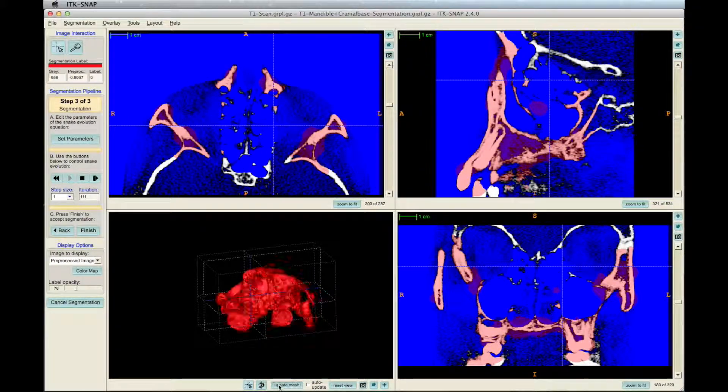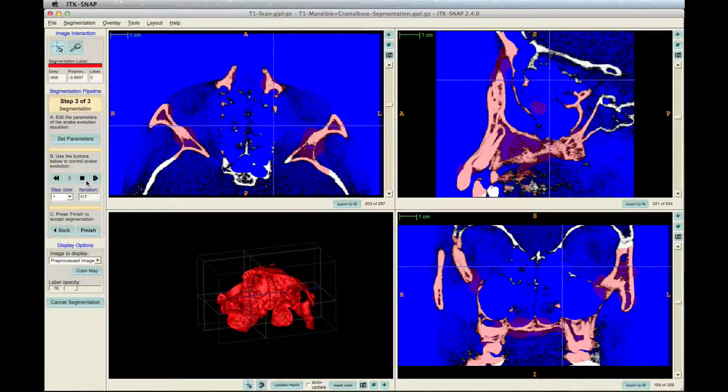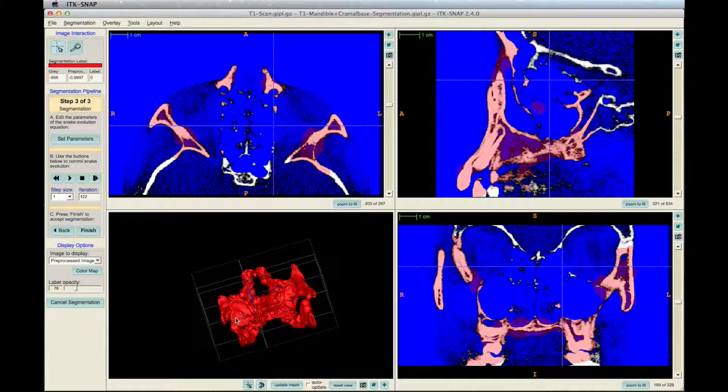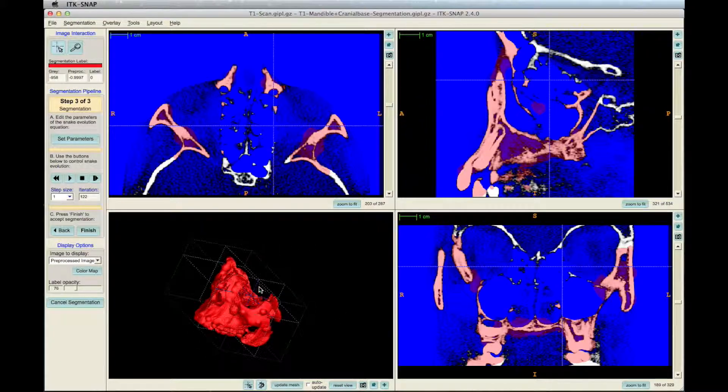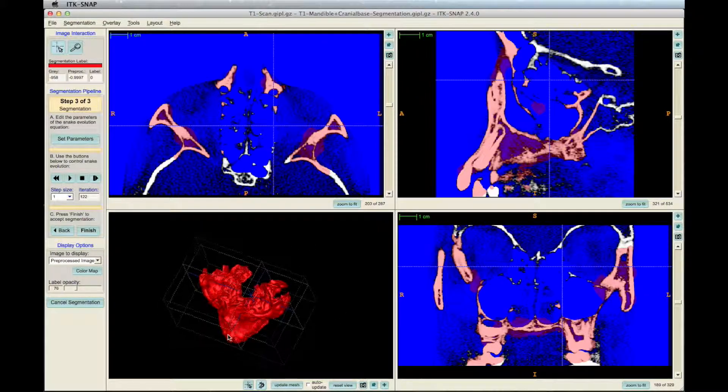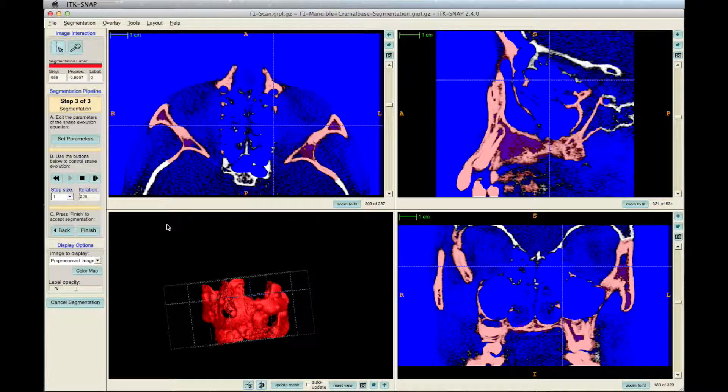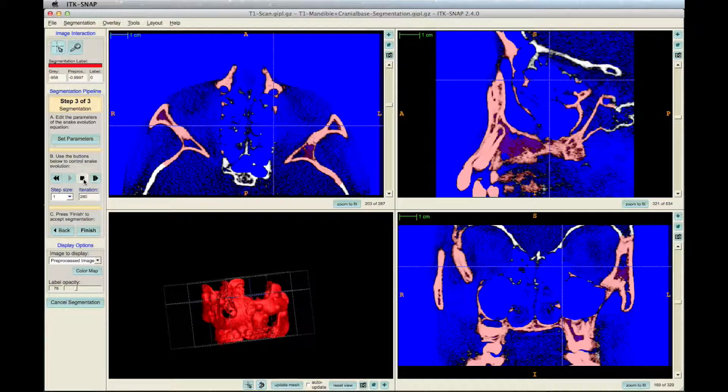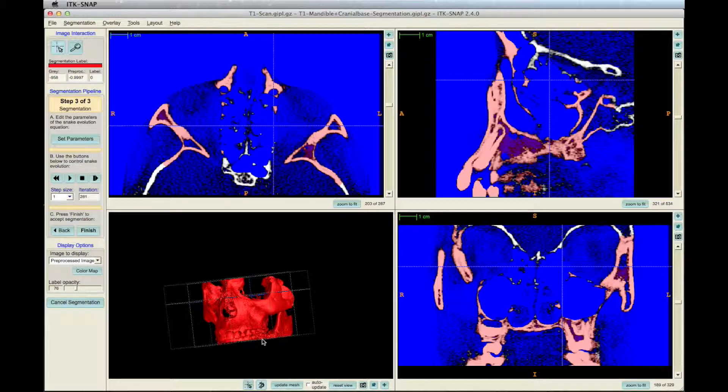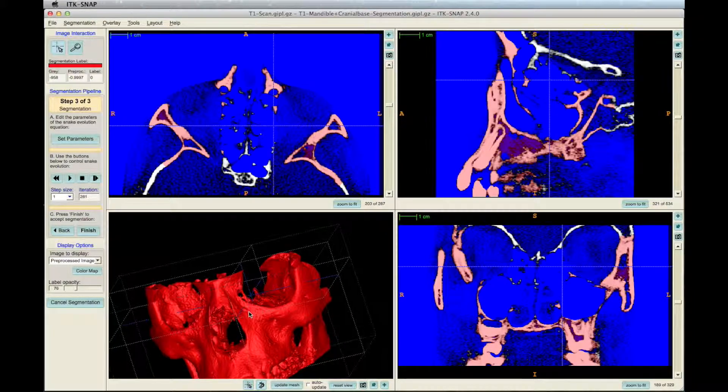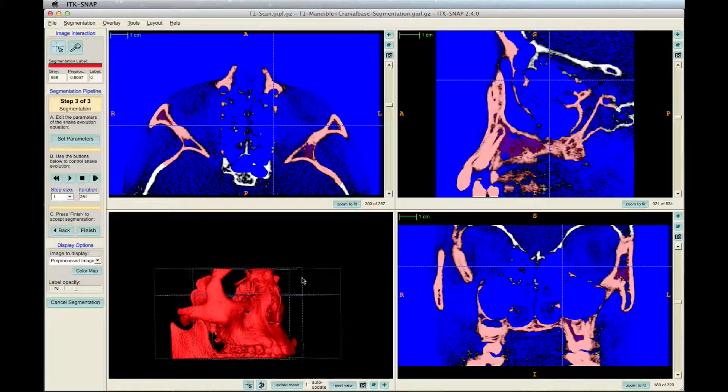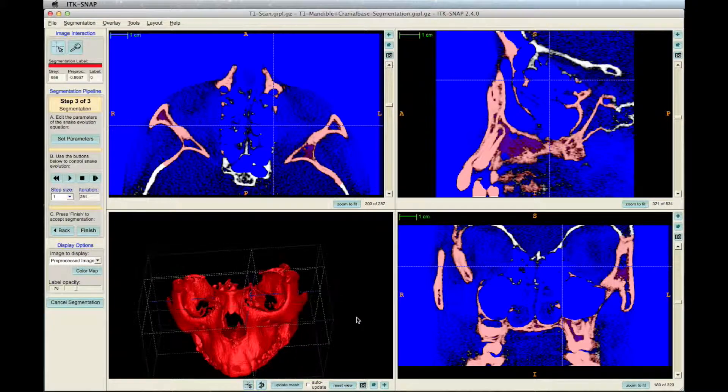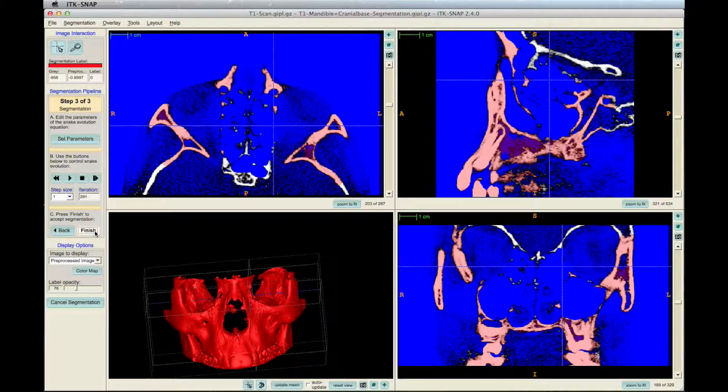You can stop the program at any time to see how the segmentation is coming along by clicking the Update Mesh icon on the bottom toolbar of the ITK Snap window. Click Finish on the left toolbar after the segmentation is completed.